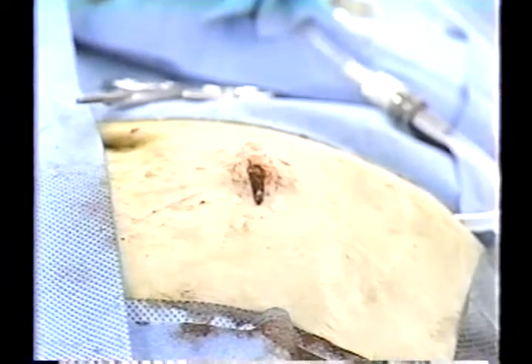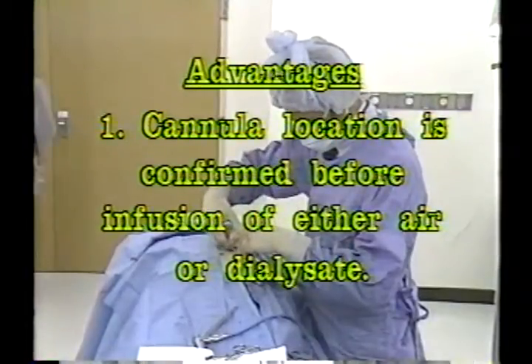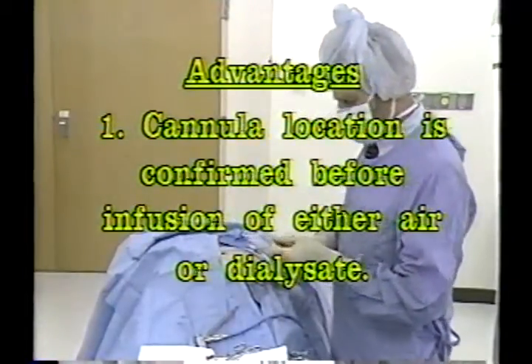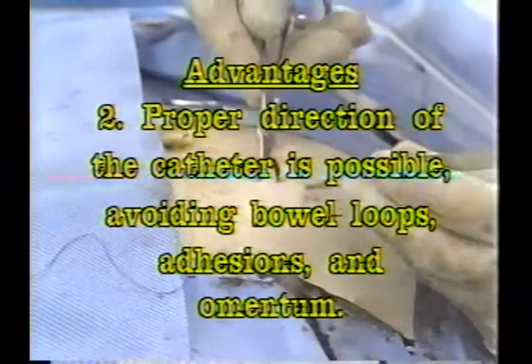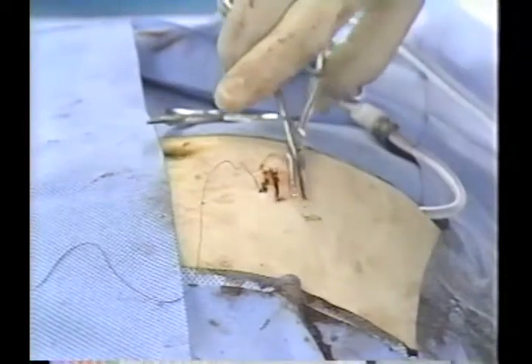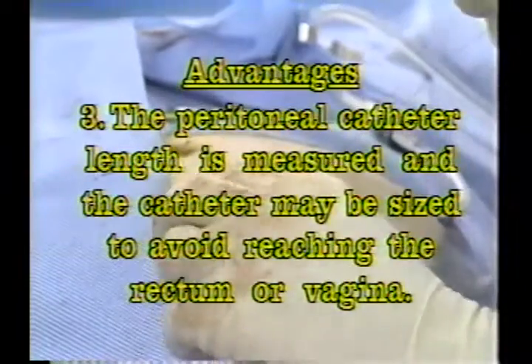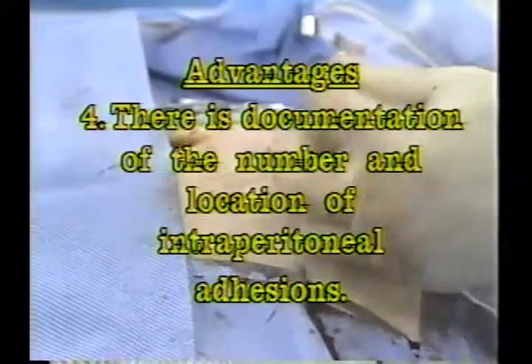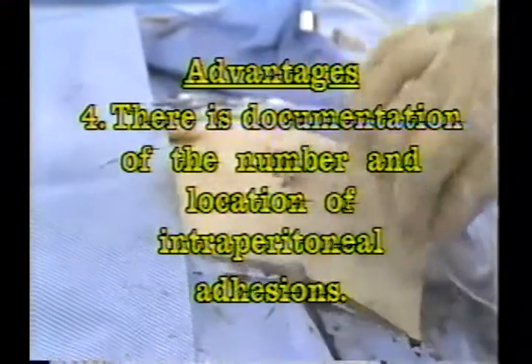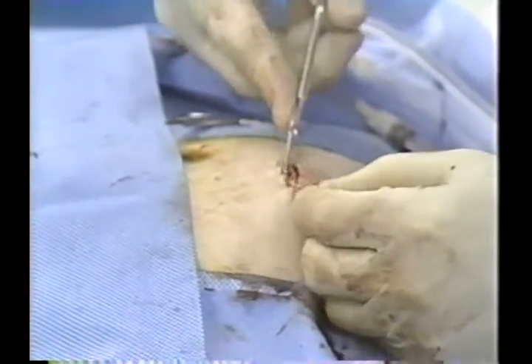The advantages of this procedure are the fact that cannula location is confirmed before infusion of either air or dialysate. Proper direction of the catheter is possible, avoiding bowel loops, adhesions, and omentum. Quite often, the proper location of the catheter is not in the lower left quadrant, but elsewhere. The peritoneal catheter length is measured, and the catheter may be sized to avoid reaching the rectum or vagina. There is documentation of the number and locations of intraperitoneal adhesions. In this patient, a future catheter would not be placed in the midline because 2 adhesions were documented there.